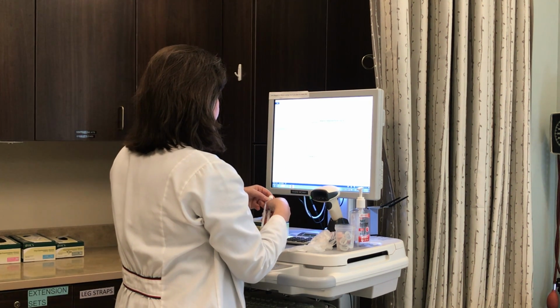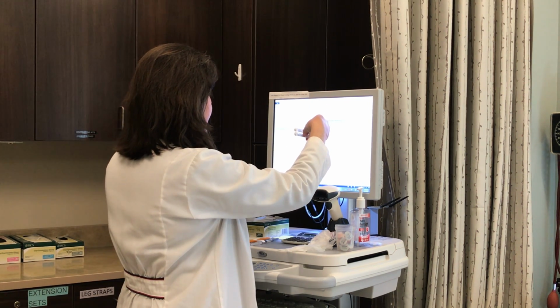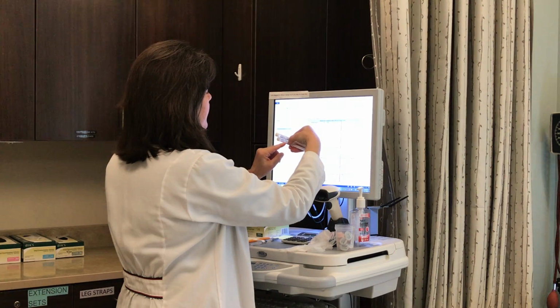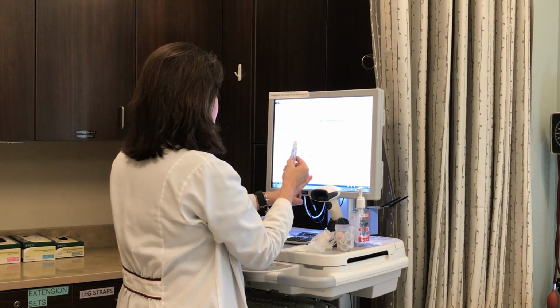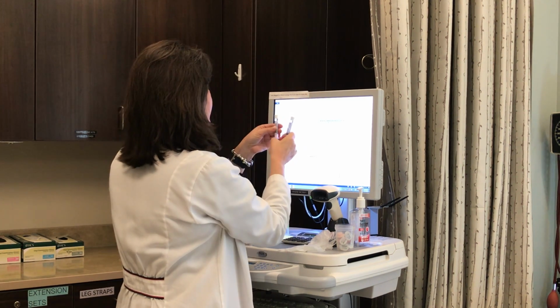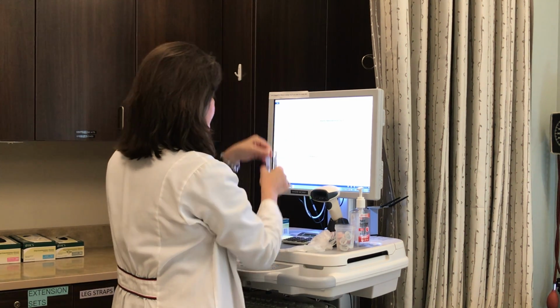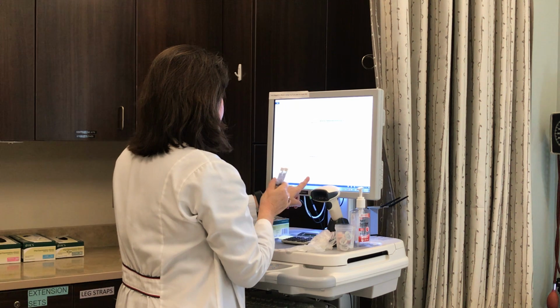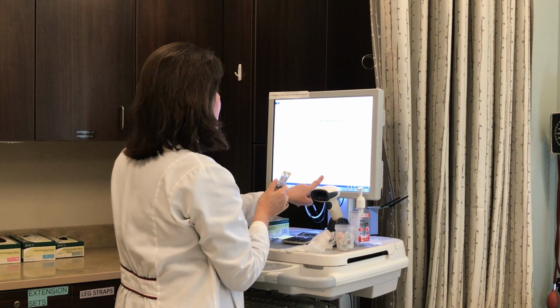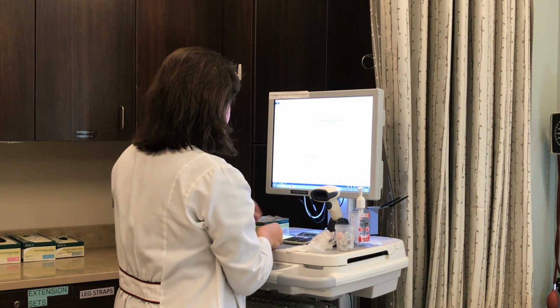Third check on my saline flushes. This is for Diane Curtin. The drug is 0.9 sodium chloride. I have 0.9 sodium chloride on the label and in the syringe. The amount is 2.5 mLs, and in my syringe I have 2.5 mLs. The route is IV push. I'm going to administer these IV push. Frequency is as needed per protocol, and the time is now, and I will be administering it now at 0900.